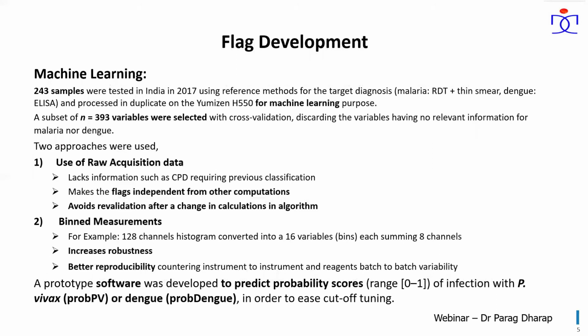So for this flag development by machine learning methods, we collected around 243 samples in India in 2017 using reference methodologies for the targeted diagnosis.